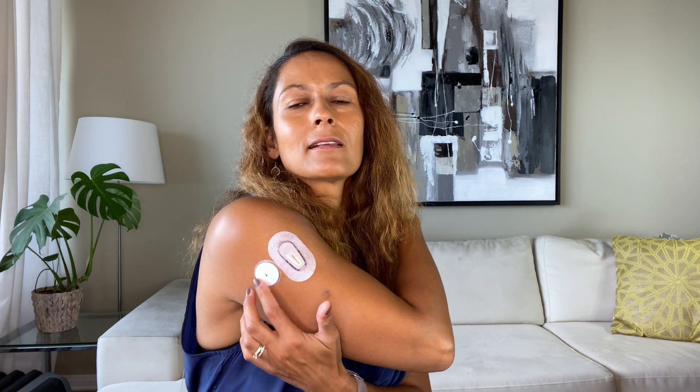Let's talk first impressions. I have both sensors on right now. When I look at the size, the Libre is clearly smaller — even though a lot of this is tape, it's still smaller. It's also flatter, which is hard to show on camera, but you can see the Libre is flatter than the Dexcom G6. From a size perspective, the Libre is definitely smaller. Pain level is the same — there was no pain, I didn't flinch when I inserted them.